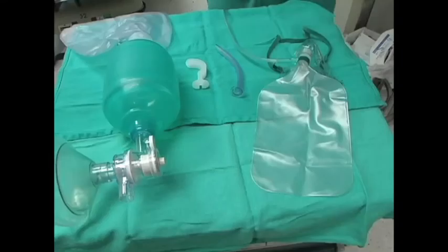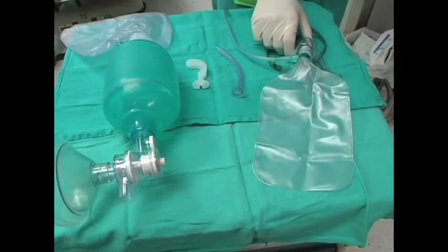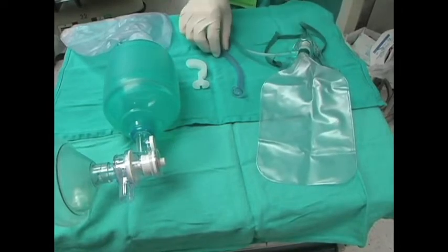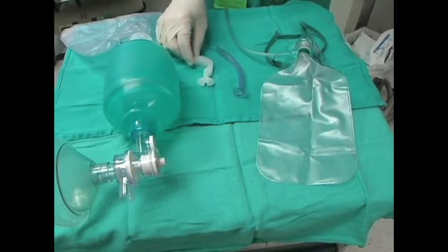The indications for oral tracheal intubation include oxygenation, ventilation, protection of the airway, and the anticipation of a clinical course that might require preventative management, such as the care of a burn patient who has sustained inhalation injury. Equipment should be accessible when needed. Equipment shown here includes pre-oxygenation equipment such as a non-rebreather mask, a nasal airway, an oral airway, and a bag valve mask device.